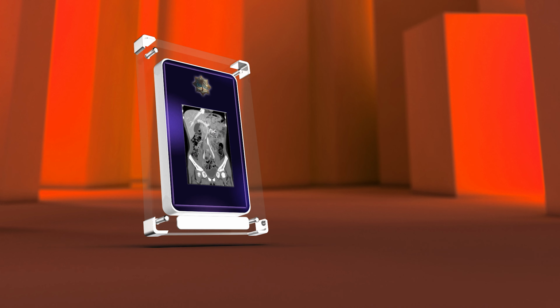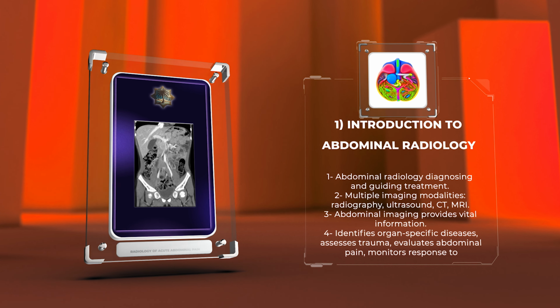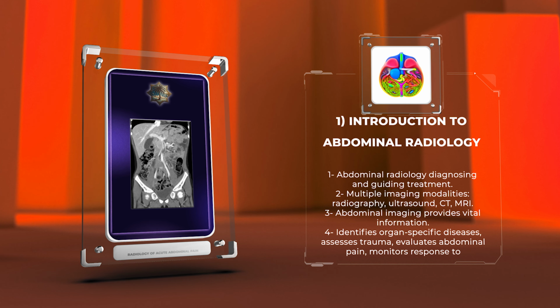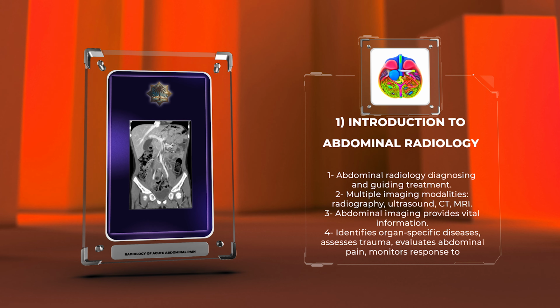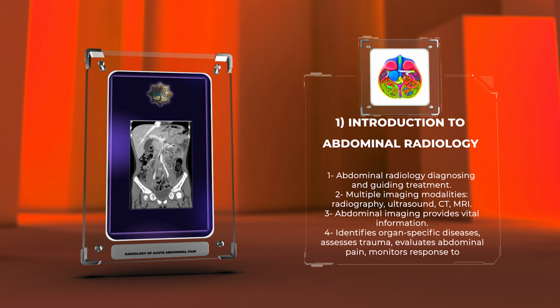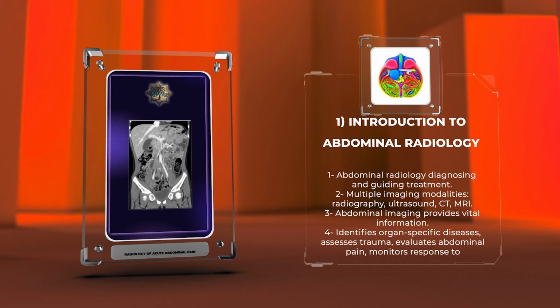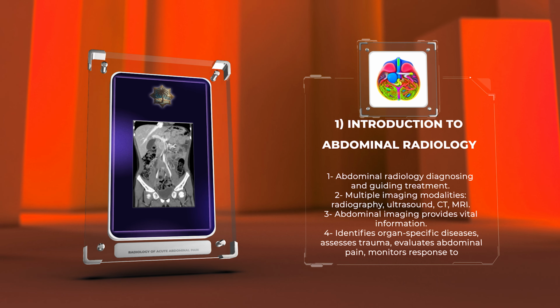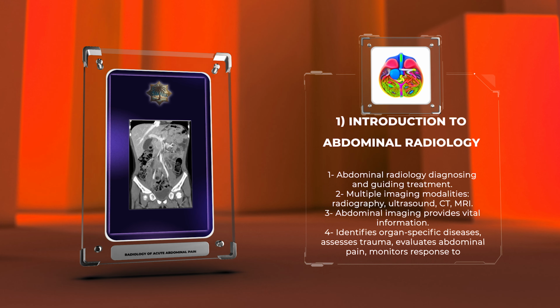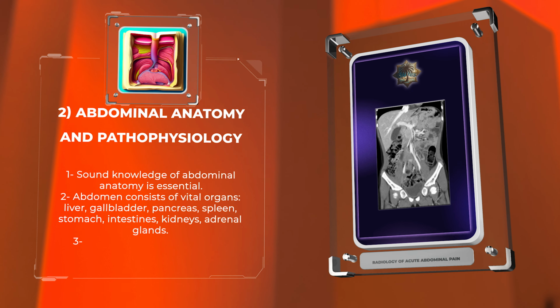Abdominal radiology plays a crucial role in diagnosing and guiding the treatment of various pathologies affecting the abdomen. It encompasses the use of multiple imaging modalities, such as radiography, ultrasound, computed tomography, CT, and magnetic resonance imaging, MRI. Abdominal imaging provides vital information about the anatomical structures, pathophysiologies, and abnormalities present within the abdomen. It helps in the identification of organ-specific diseases, assessment of trauma, evaluation of abdominal pain, and monitoring the response to therapeutic interventions. To understand abdominal radiology, it is essential to have a sound knowledge of the abdominal anatomy.